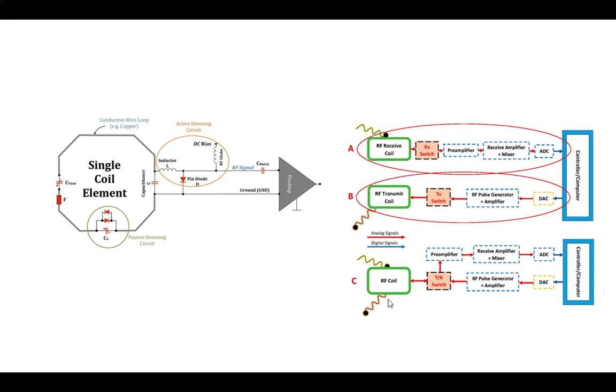You don't want to accidentally turn that on and have feedback around through to it, so you have a transmitter switch to prevent any small amounts of bias going through that heavy amplifier. You can combine that here by switching which one it goes to, or neither. You do need the neither option because you don't want it pulsing accidentally, or receiving and getting damaged accidentally.